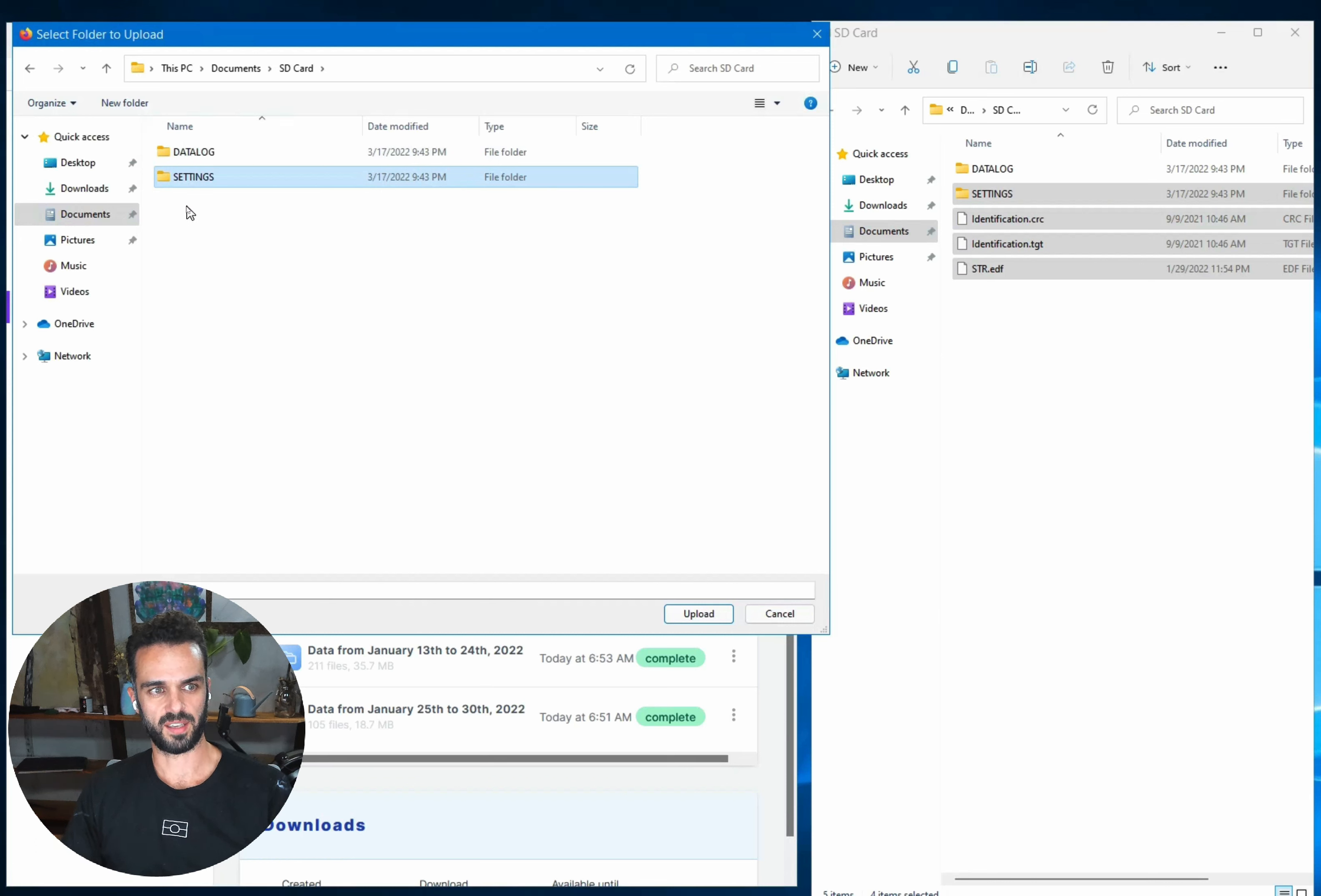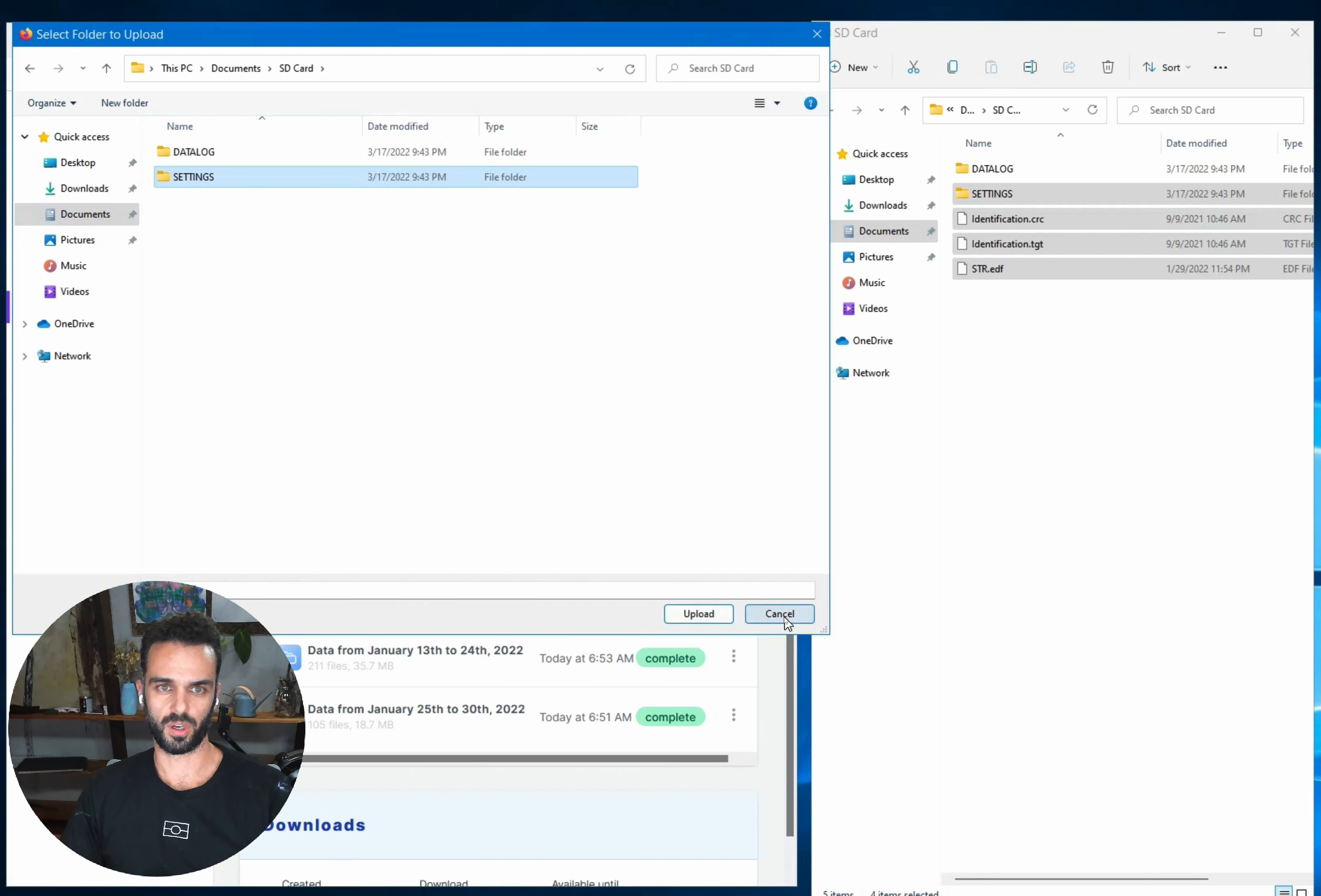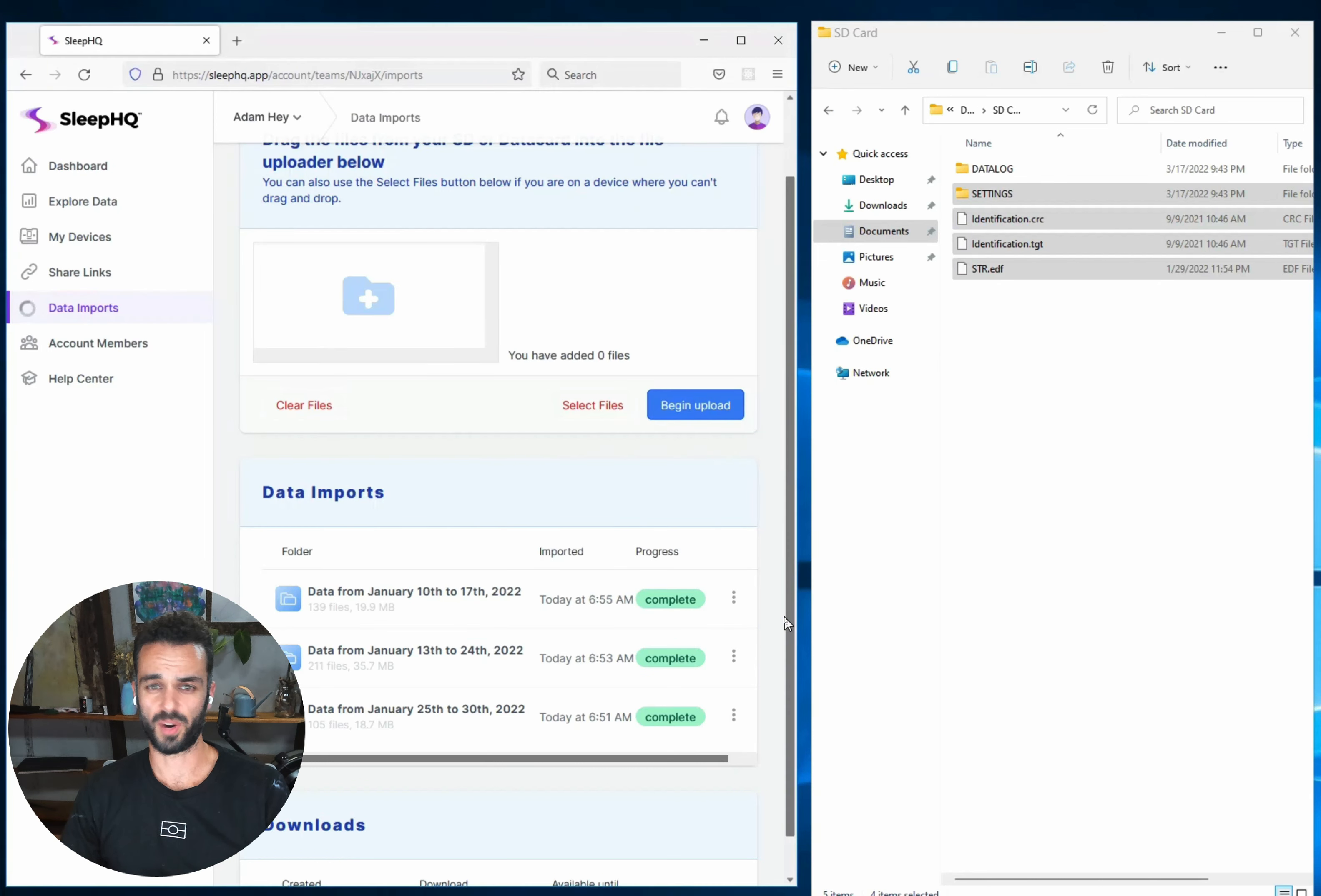So you can see here, I've gone into my SD card, but I'm actually missing the identification files. And that's unfortunately just the way that the select files buttons work with browsers. We're not able to let you select a folder and a file. And again, it depends on the browser that you're on.